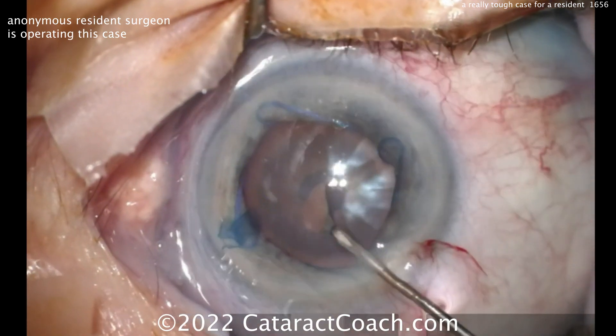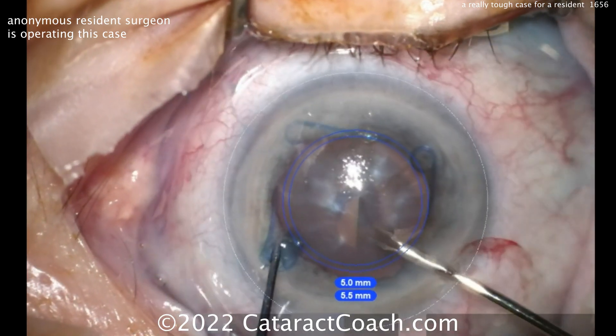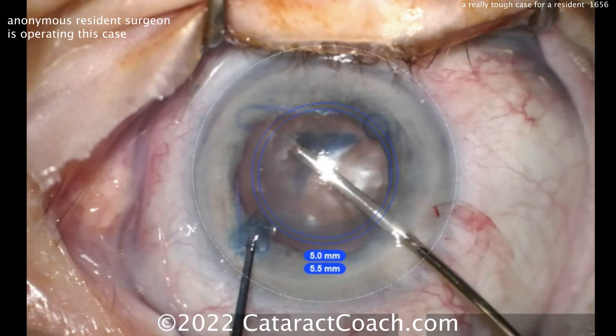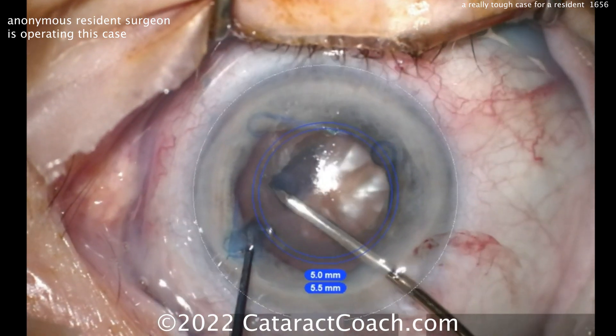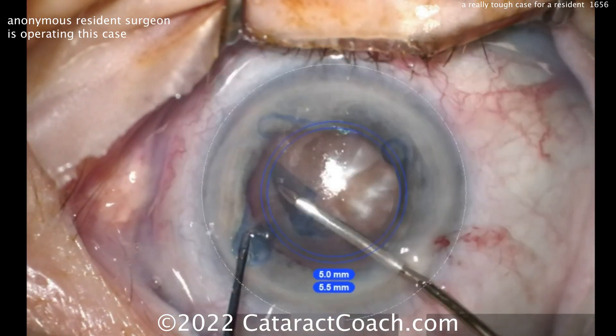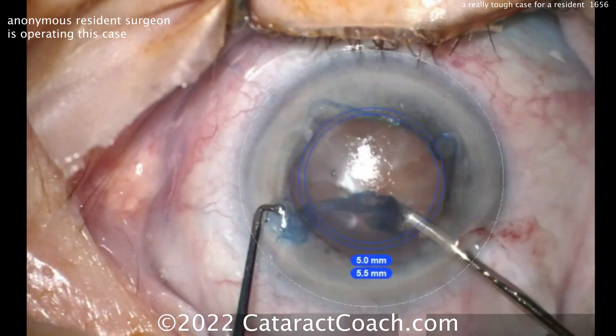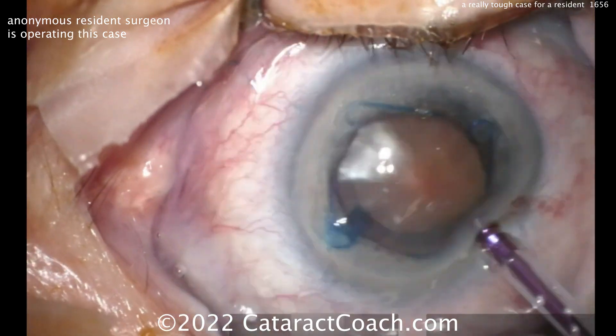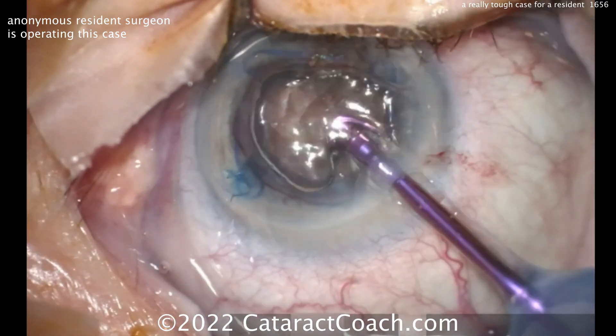Let's get the rhexis done. TriPan blue dye — thank goodness — was used. I like these micro forceps; those are fancy. Getting a nice rhexis here. You want to be cautious — don't make a baby rhexis. Remember, this is a small eye; it's going to look like a huge rhexis, but it'll be fine. And wow, that's really a nice dense cataract.